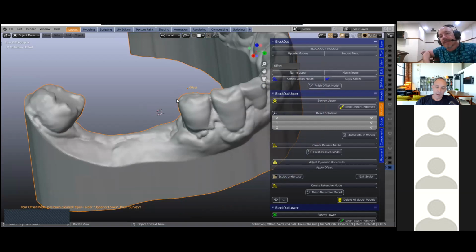Yes, that's correct. We are currently busy with the MIS. Next week we should have the analog, the scan body, and the parts for making crown and bridge models, the implant models. We have the abutments, but we haven't got the MIS from the MIS company. We've got the MIS from Steco, but not from the MIS company. No, we haven't got those yet. But Medentika, we've got all of the components.